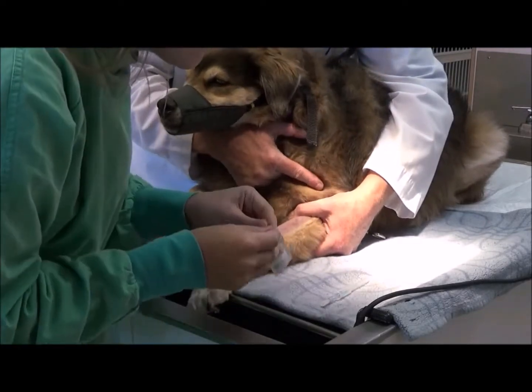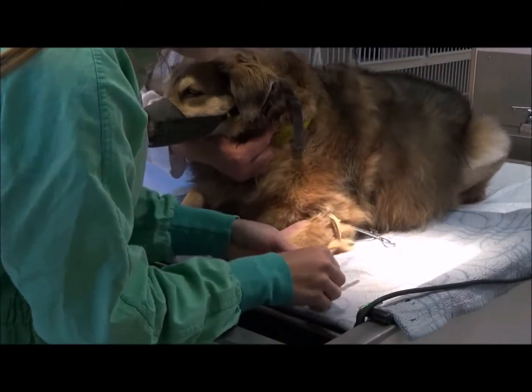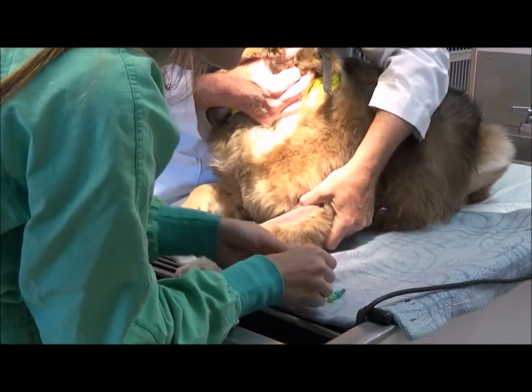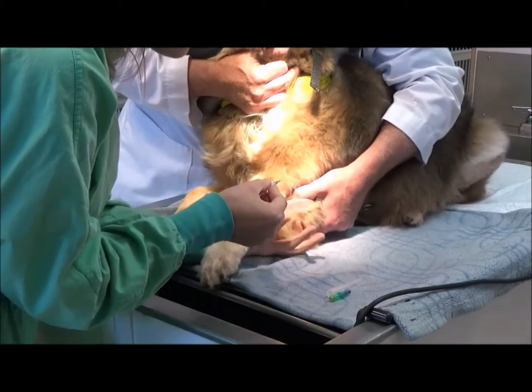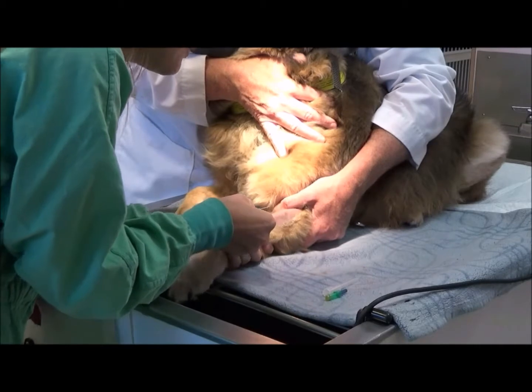I'm going to open my plug here too, just to have it ready. Yes, you always want to get your light in a good area too to help you see better. So I'm placing the catheter. Make sure you place the beveled side up at a 10 to 20 degree angle.